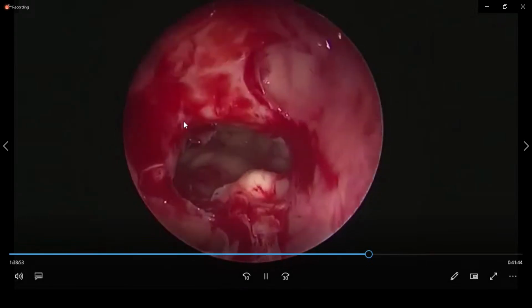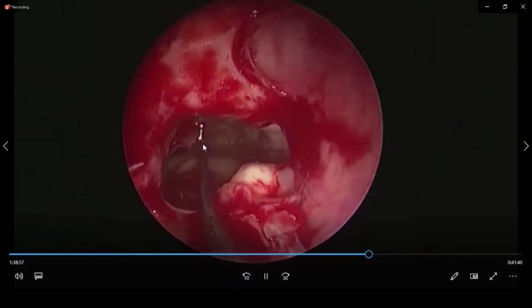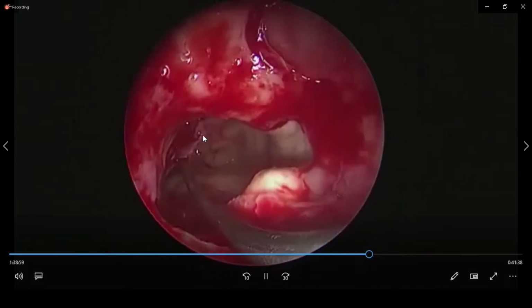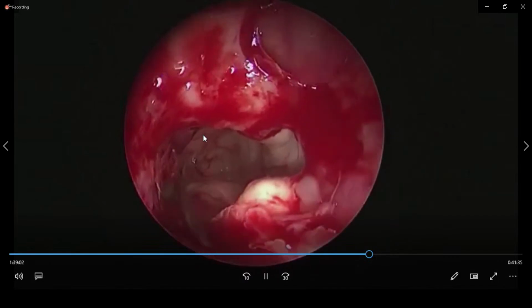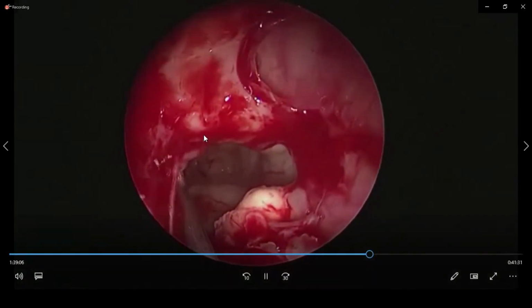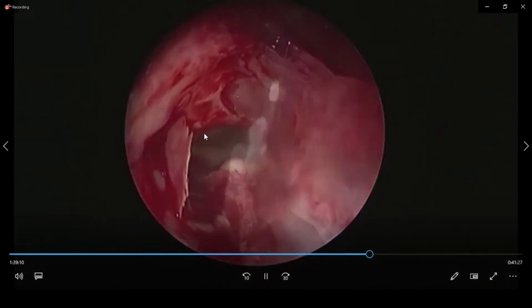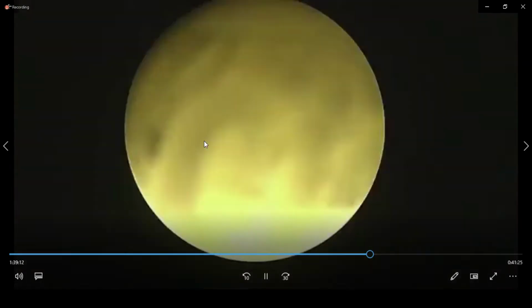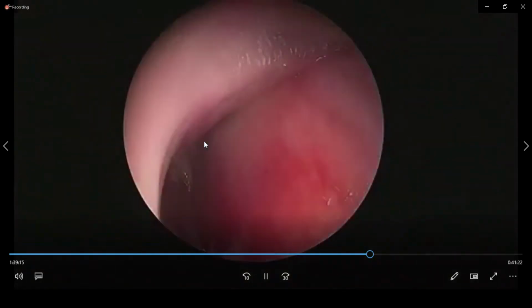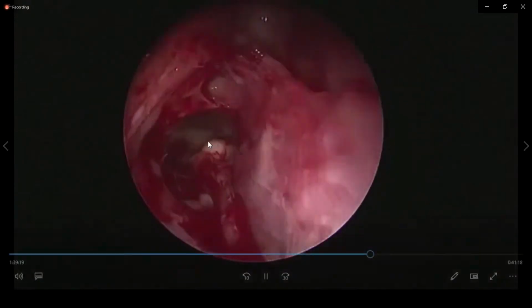See now how big the frontal sinus is? Yes. After removing that party wall, still that party wall is remaining, and see the frontal sinus being widened. More and more, it should be widened. This entire cell wall being removed. See now? Yes. Widen it. This is very important to give adequate frontal sinus drainage, adequate and optimum.